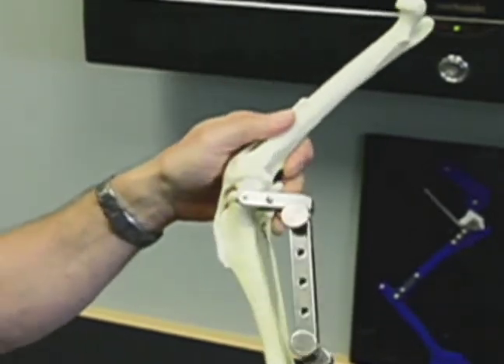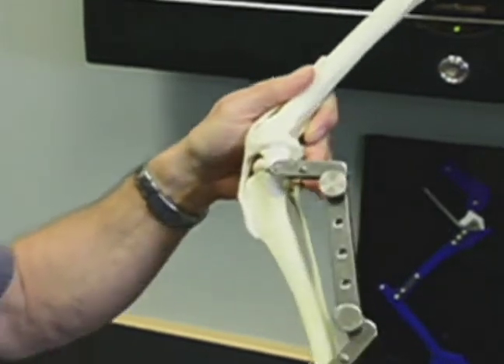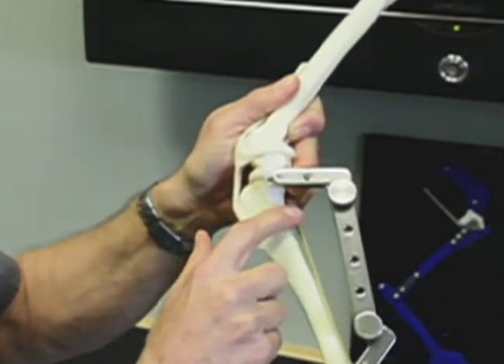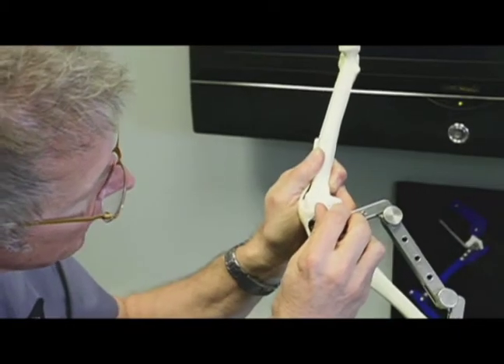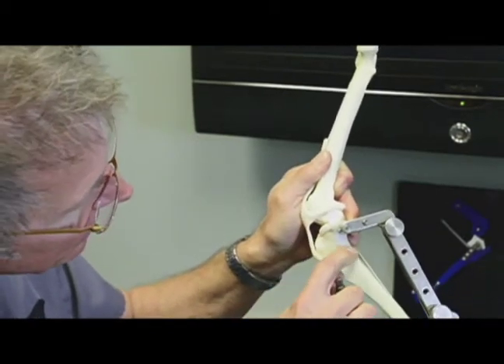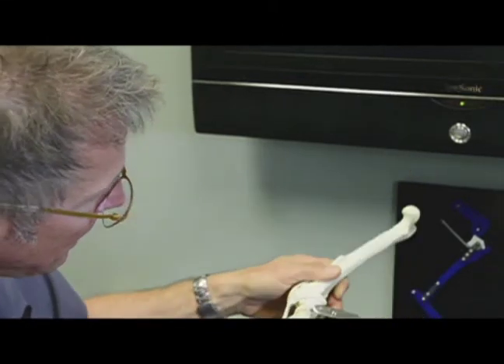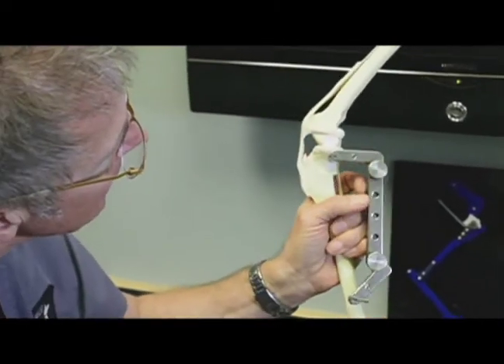The purpose of the jig is to hold the bone in appropriate alignment after we've made our cut. Not all surgeons use a jig — I do, but it's personal preference. Once the jig is in place, we use an oscillating saw. We have about ten different sizes of saw blades that can be placed appropriately on the bone. They vibrate and oscillate in a fine motion to make a very precise cut.